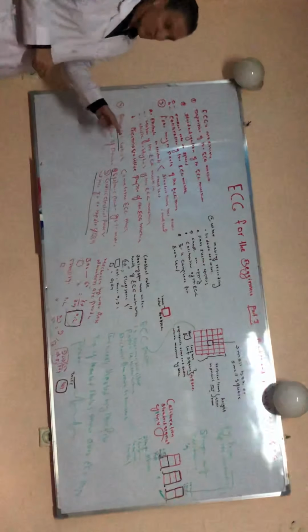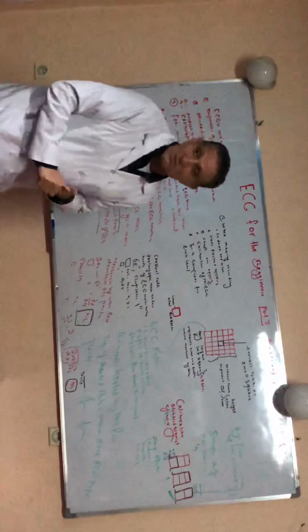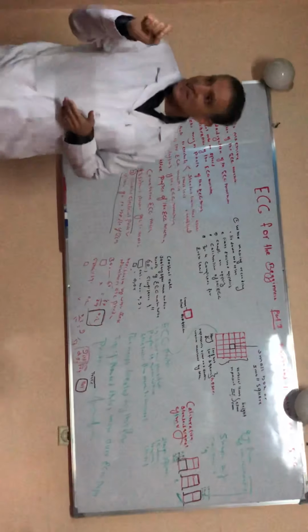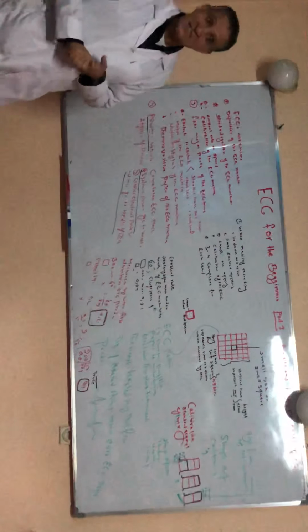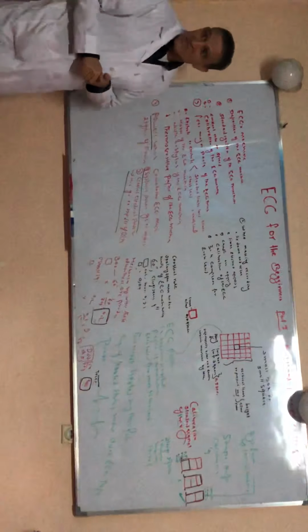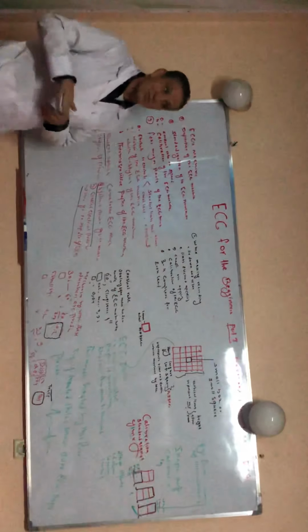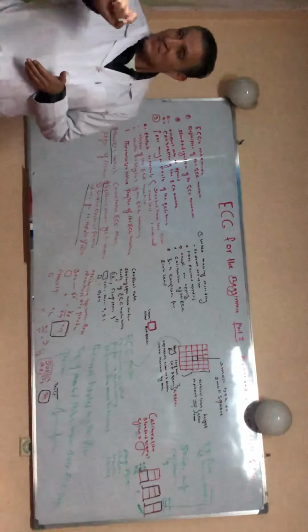This electricity which comes from the systemic or general supply should not be confused with the cardiac electrical force. There are 2 types of electrical force that come to the ECG machine. One is general power, the second is cardiac electrical force. The general power goes to the motor and the cardiac electrical power goes to the needle and leads to deflection of the needle of the ECG machine. And when the needle is heated by this electrical impulse, it moves over the ECG paper and produces the trace of the ECG.